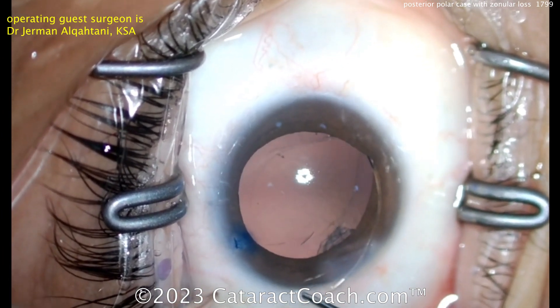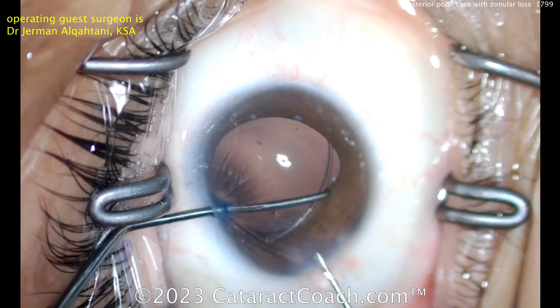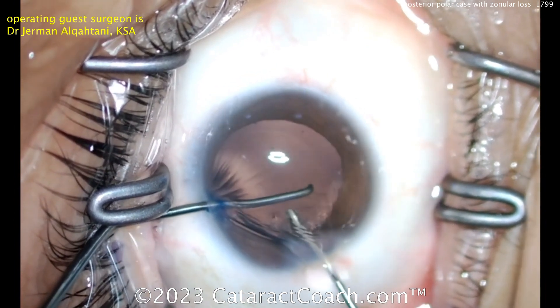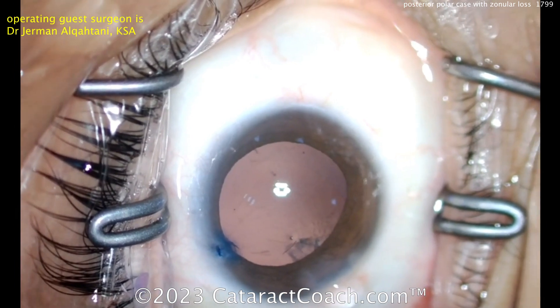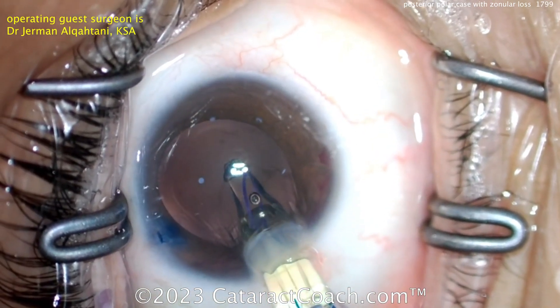If you didn't have a CTR, you could also put a three-piece lens in the bag with the haptics angulated toward the area of zonular weakness to push out and bolster that area. But I do like the idea of placing a CTR — a capsule tension ring — that's a very good choice, along with a three-piece lens as well.